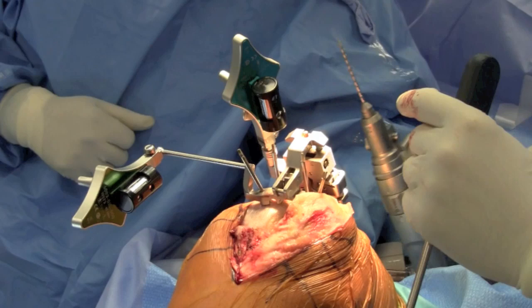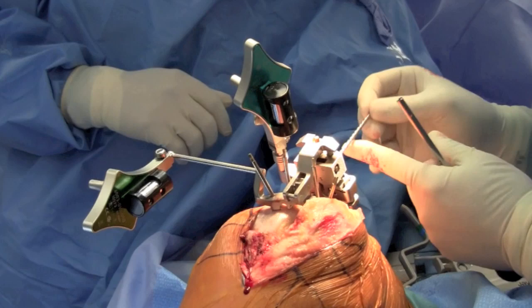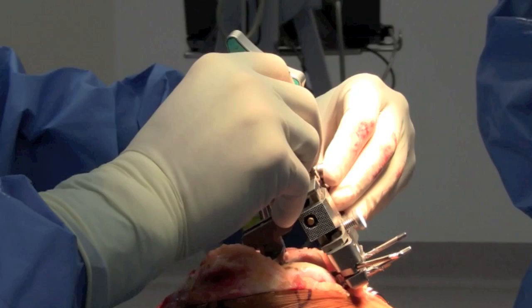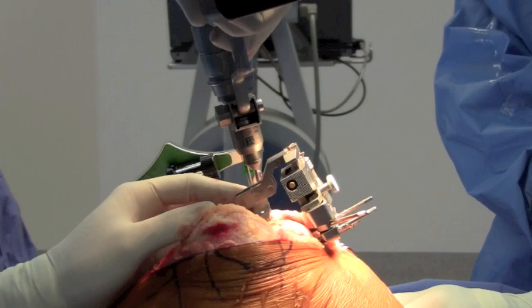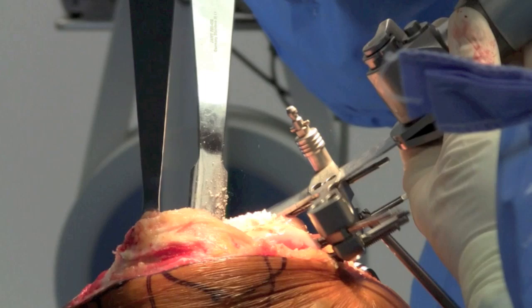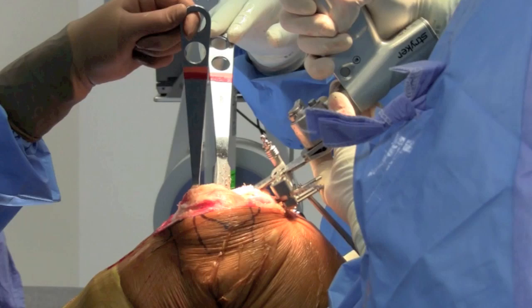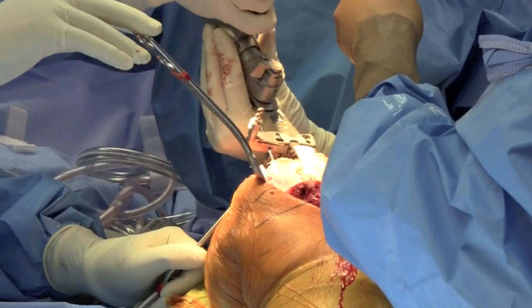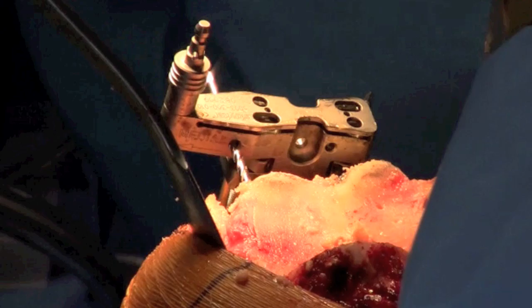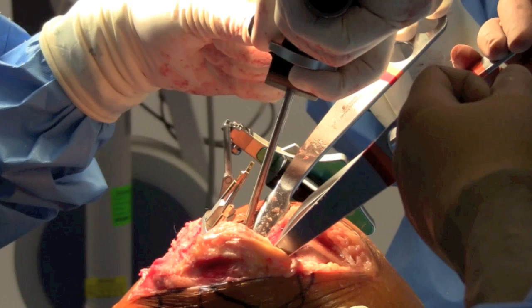There you can see the yellow line indicates where my cut will be if I leave the jig where it is. Here you can see the whole apparatus. There's a pin going into the cutting guide, and that cutting guide is connected to the sensor that I pinned to the femur earlier — that's how the computer knows where the cutting guide is in space. Now I'm able to remove all my sensors. The cutting guide is firmly pinned to the end of the femur and I'll make my distal femoral cut. I know that this cut is appropriately aligned with the mechanical axis based on all of those landmarks we took. But at any time, if I don't feel comfortable with the way the cut looks based on the anatomy, then I can change that guide — and that's how it's different than robotic surgery or preoperative computer planning. There you can see my distal femoral cut is complete, and I'm very happy with the way that looks.